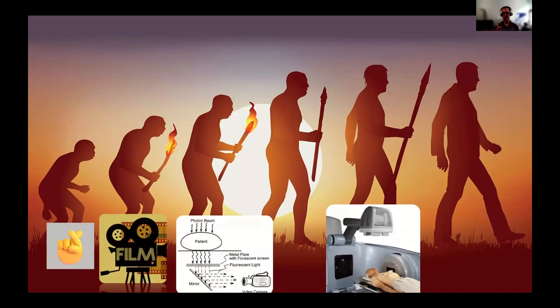We installed that at my centre on some of our Linacs in around 2012, and prior to that on another one. That gave us much better soft tissue definition, and we use it now daily for almost every treatment site.